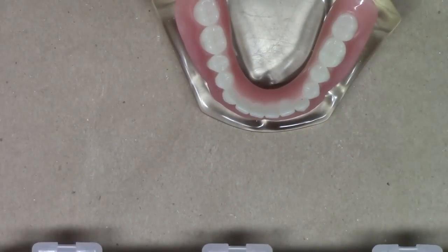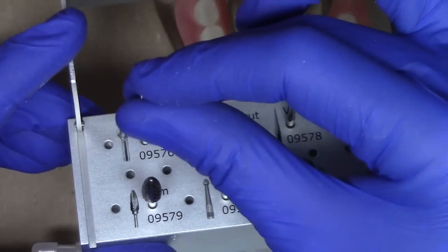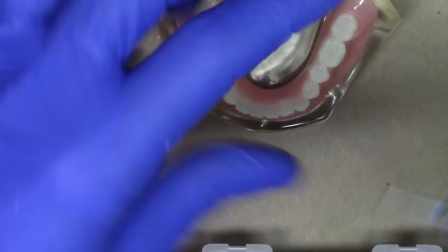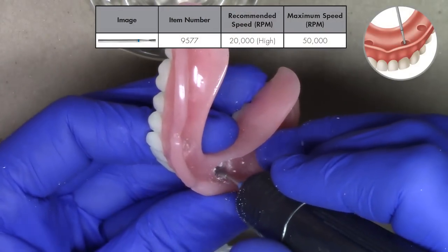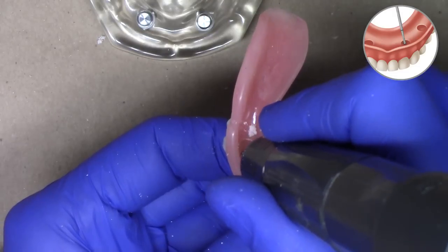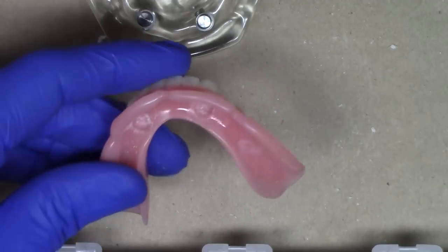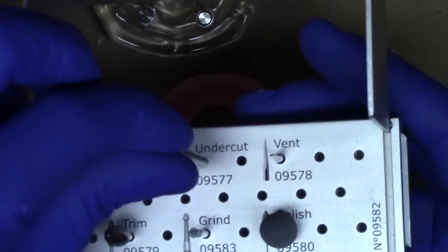We can now go ahead and utilize our second burr, which is the recess undercut burr. Pulling out the undercut burr, I'm going to prepare an undercut. Utilizing the undercut burr also on high speed, I'll trace along the sides of the wall of the complete denture, providing mechanical undercuts and locking the chairside material into place. Now I have used the undercut burr, also at high speed.